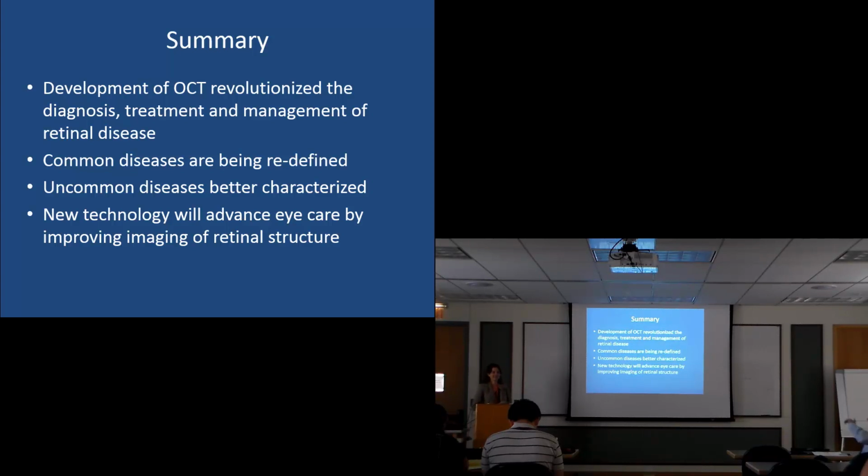So, yes. What's your impression of clinical interest in adoption of adaptive optics? I do think that among the people at the reading centers and the tertiary referral centers, it's high, because a lot of diseases devastate vision at the photoreceptor. That's what we want to know about. What I'm seeing with infectious diseases, it mostly affects the photoreceptors, and it's really changing how we approach infectious diseases in the eye.